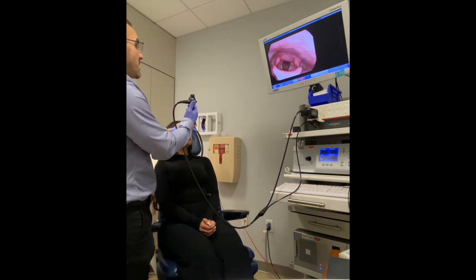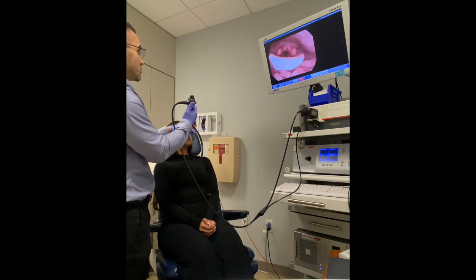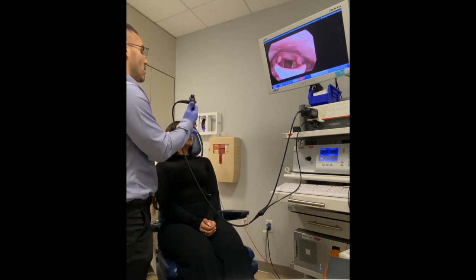What we think is going to be helpful for you from a swallowing standpoint is for you to learn to hold your breath and close off your vocal folds before you swallow, then maintain that vocal fold closure as you go immediately into a swallow, and then give a little cough right after you swallow before you open up your vocal folds. That's what we want to train you to do over these next couple of minutes and have you practice at home without the camera.